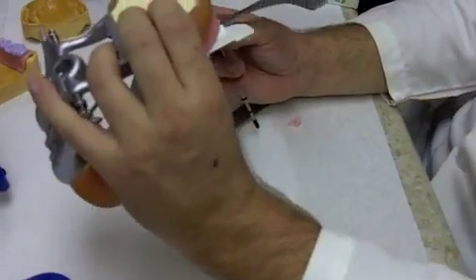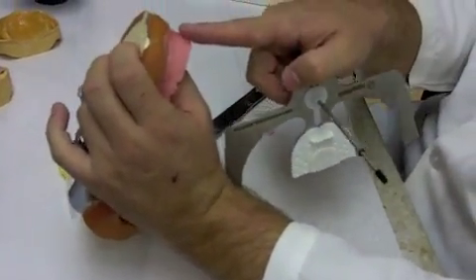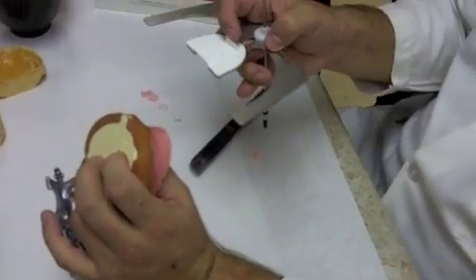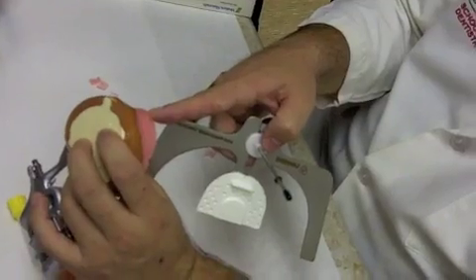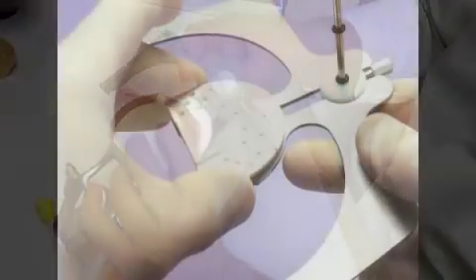Now usually you've set a couple of central incisors at least on a patient. Maybe you have set the anterior 6 teeth. But the thing about the facebow is you want to make sure the patient's head is in a neutral position. You want that little white plate that you see on the tray right up against your rim if it's in the patient's mouth. And we'll show you that. We'll give you some demonstration here.